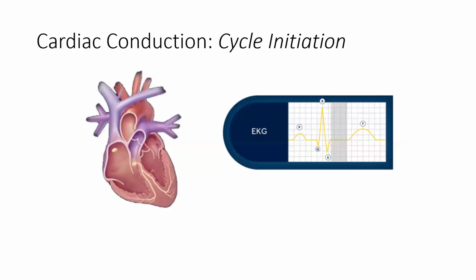Again, as we move on, following the QRS complex, the ECG shows that it has gone into a plateau, as you can see on the gray wave, which lasts for several milliseconds. And then what happens is repolarization of the ventricles, generating a current in the body to produce that T wave, the upward deflection. Of course, this happens slowly, thus generating quite a wide wave, which represents the T wave.